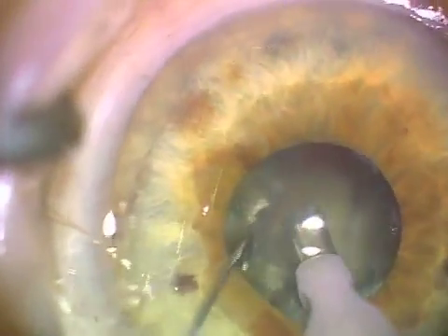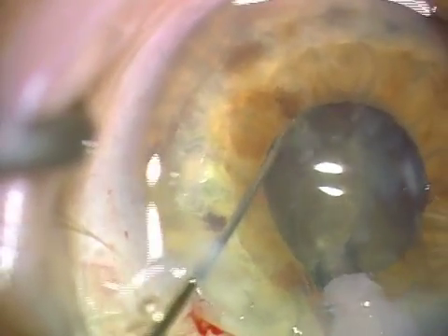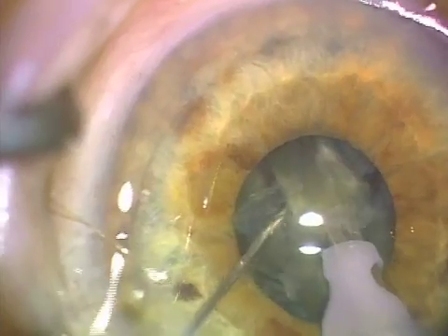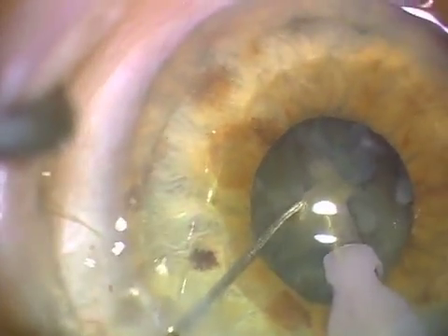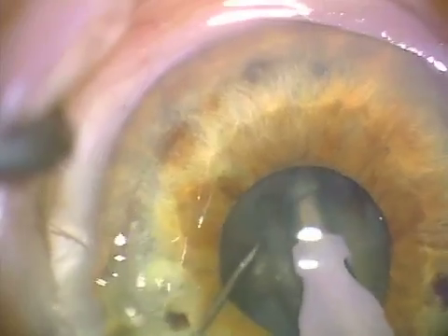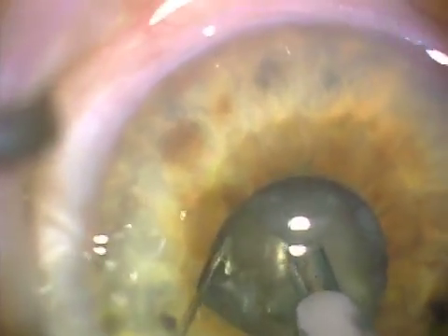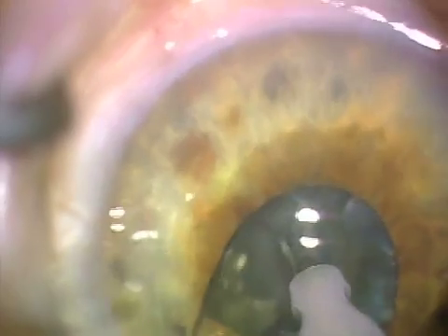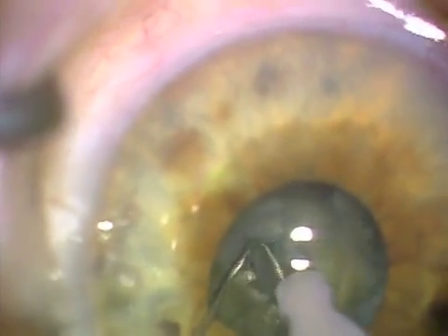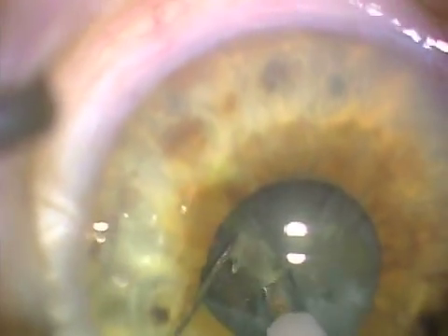If you watch this again, notice how little the phaco tip moves away from the center of the pupil — and that's why I like to use this technique routinely, so that when I get into a small pupil case, it's familiar maneuvers to be able to work in the center of the pupil and not require iris hooks for expanding the pupil.